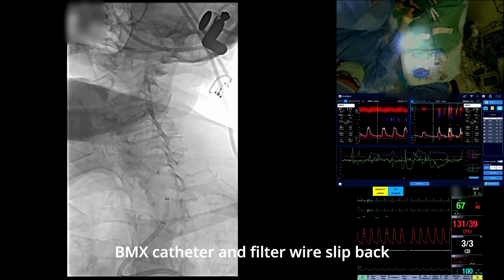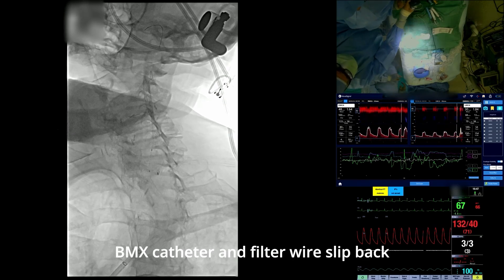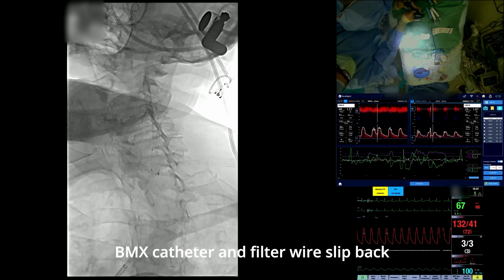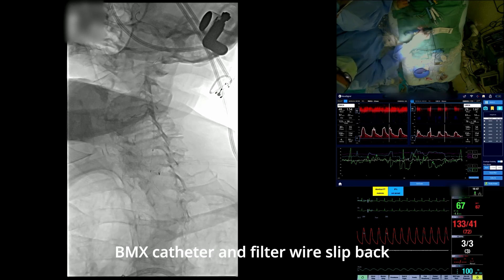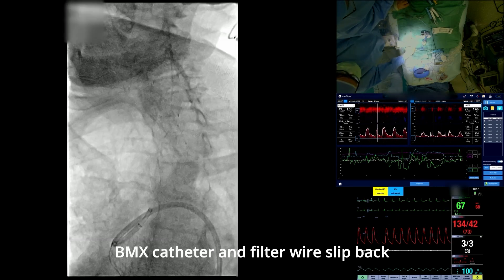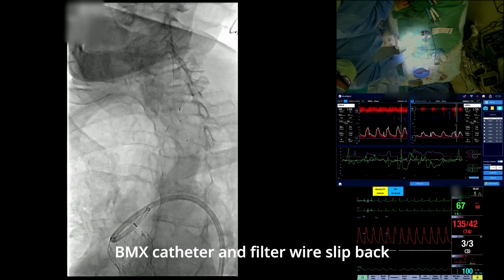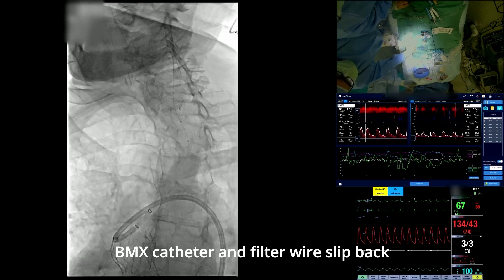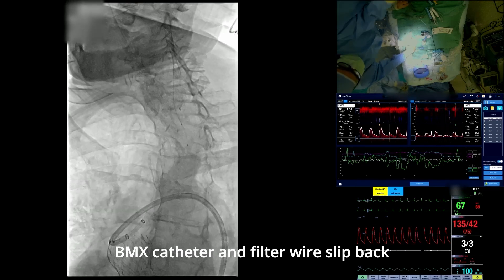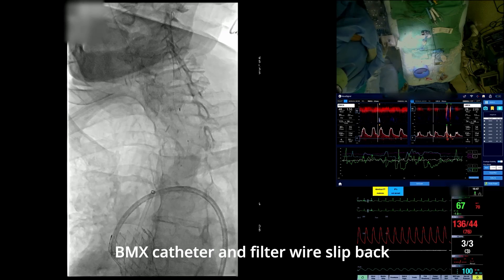The BMX catheter ended up bouncing out of the left CCA and carried the filter wire with it, and the filter basket did not remain beyond the distal end of the stent. Unfortunately, no flow disruption was noted on the TCD during all of this.